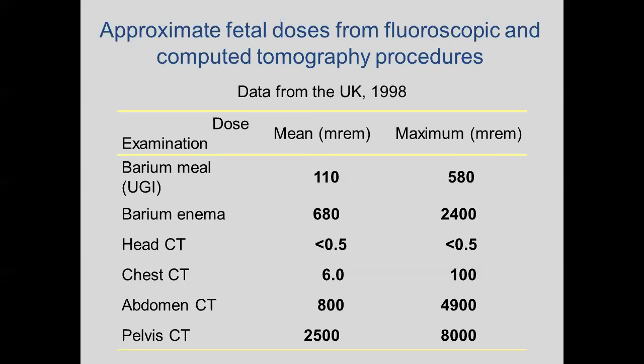So once again, what would be the risks of that? Once again, the effective doses that we give in a PCI type environment is similar to what you'd get from a chest CT. So the actual fetal dose is still very small. You know, get access, get down, hopefully you can do it without fluoroscopic guidance and just stay on the chest. The radiation dose to the fetus should be very small. Okay. So yeah, I'd never even heard of that scenario, and I was thinking about that. So there you go. It can happen to you.